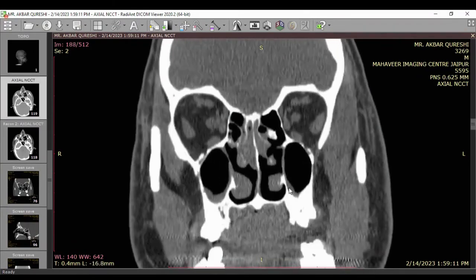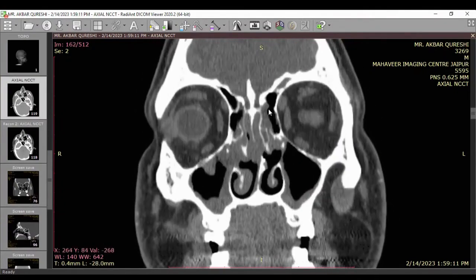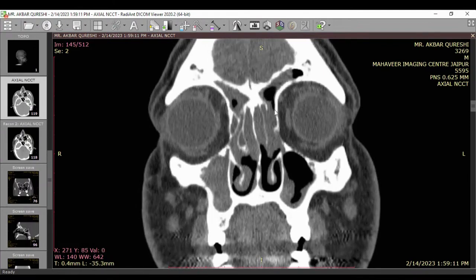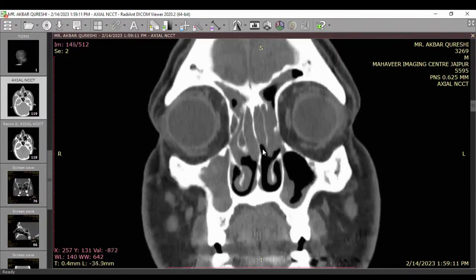Another important finding is, because of this CCAD the patient presented with olfaction loss, because of the obliteration of the frontal recess with some anatomical abnormality. See this anatomical abnormality, what a big cell it was. It is predisposed to frontal sinusitis. These are the two reasons why this patient is having problems. Additional problem, the turbinates are laterally placed. Can you see this? See, this turbinate is so laterally pushed because of the disease medial to it.